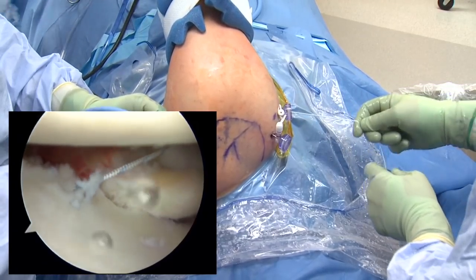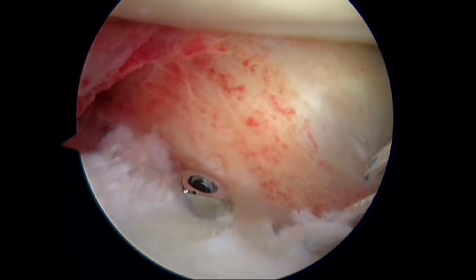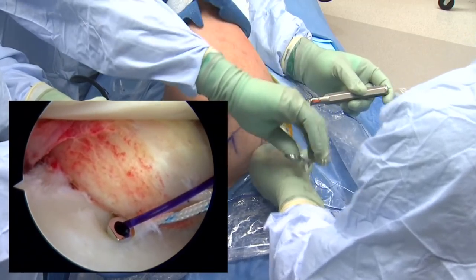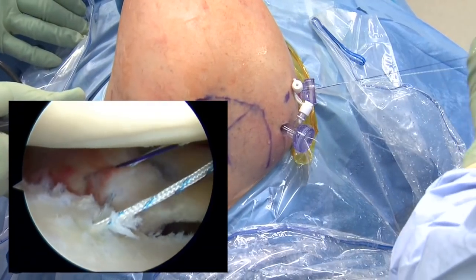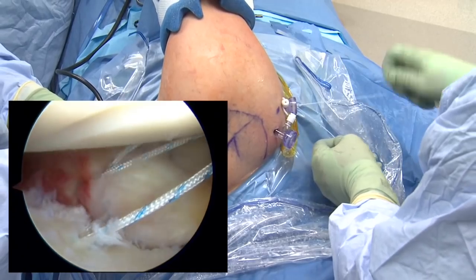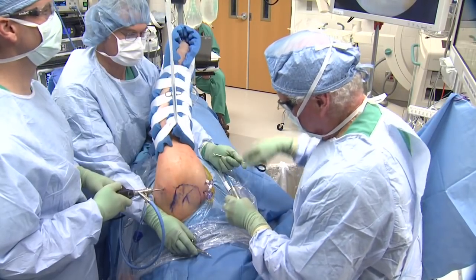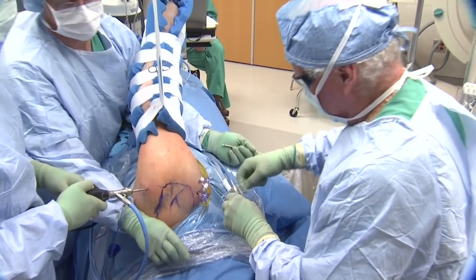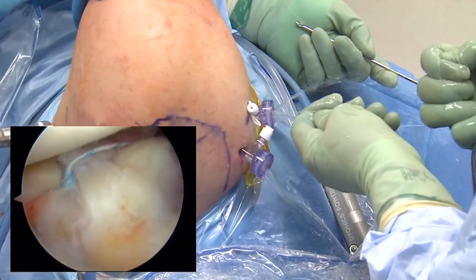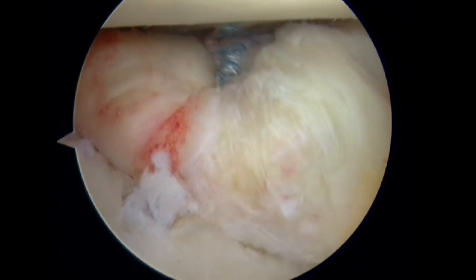Now you can see we have a simple suture there, and here we come again with another pass with our PDS suture, pulling it through in similar fashion. Now we have a mattress ready to tie down. The amount of capsule and labrum we take depends upon the pathology present and the amount of translation of the humeral head under anesthesia — a lot of translation requires a bigger operation, more capsule and labrum. Here we're tying an SMC knot; you need a sliding knot to secure it down. You can see the mattress puts the knot safely out of the way. We always do our pass-pointing to confirm a secure knot and test with our probe.